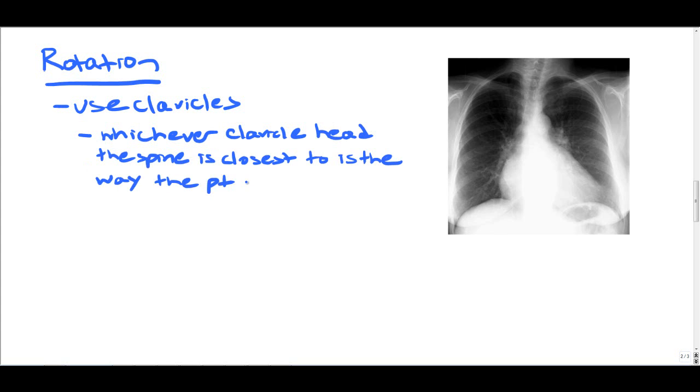And again, this is really important because this will throw off the anatomy, it'll throw off the size of the heart, it'll throw off a lot of features of the x-ray if you are unable to determine the patient's rotation.